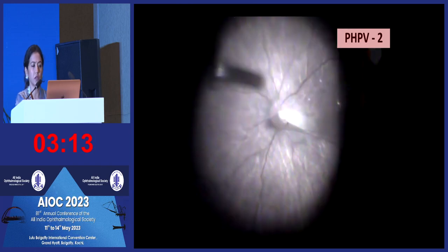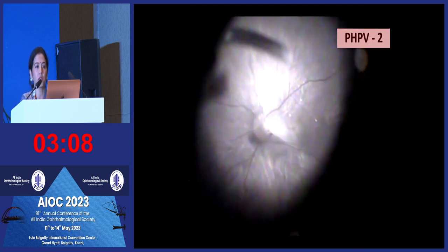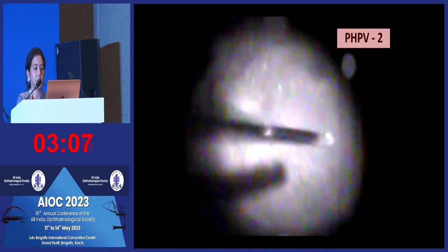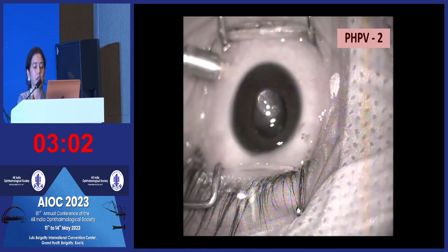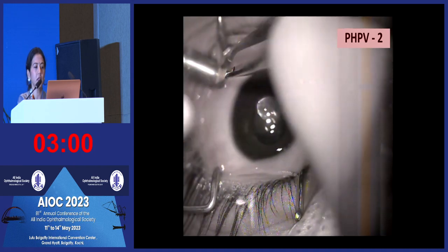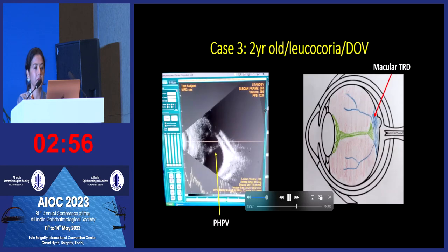This was also not very vascular. If it is, then you have to make sure that you cauterize before you go around cutting and trimming it to the disc. And then a core vitrectomy, something like an ROP. You don't have to be very aggressive in your vitrectomy. A core vitrectomy can be done, and a fluid air exchange was done.